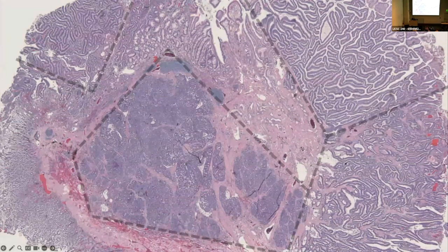If you start doing a couple of IHCs, you can often figure out if you're not getting the reactivity you're supposed to be getting. At least for what we're doing with HuBMAP, we have an on-slide array control, a set of positives and negatives to go along with our sample tissue. If the QC tissue on the same slide is not staining properly, then we're probably going to flag that for not including that data.